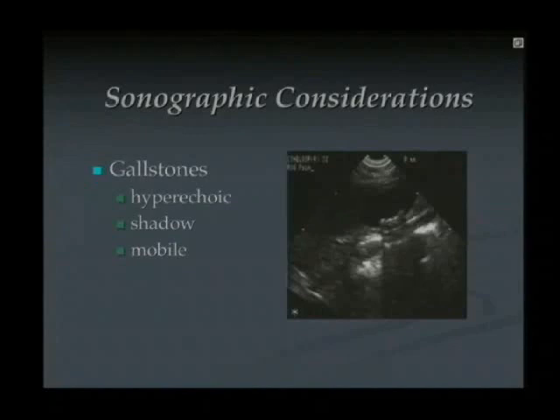And I'll tell you right now, the gallbladder is probably the most difficult study that we will do. No doubt in my mind. It's the most difficult study, because there's a lot of pitfalls in the right upper quadrant, including simple abdominal gas. And gas is really your enemy in ultrasound. It causes difficulty in scanning, and it'll cause shadows. And if you don't know definitely you're in a gallbladder and you see the shadow, you think this is a gallstone, you'll make a mistake. So you want to make sure you're seeing the gallbladder, and then do they have a stone within it.